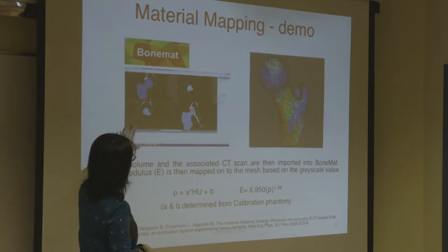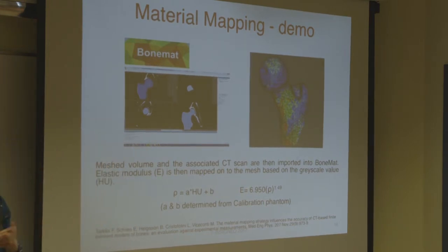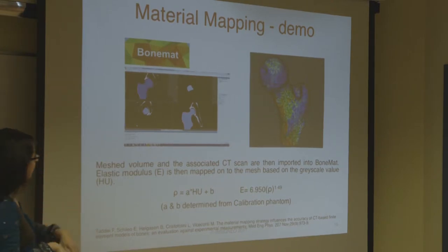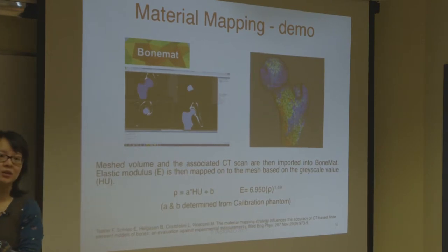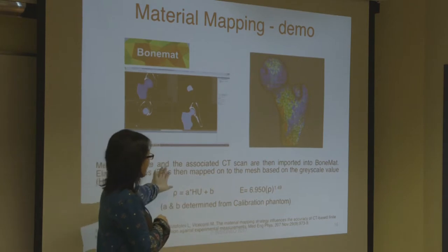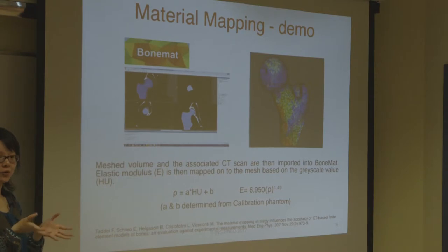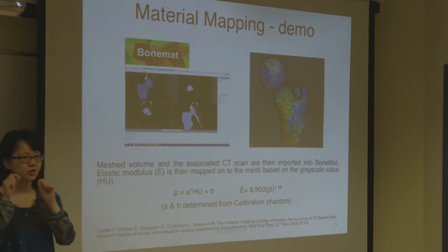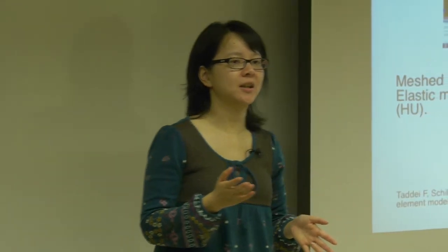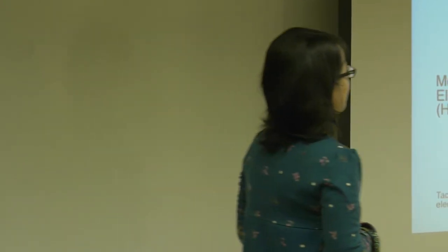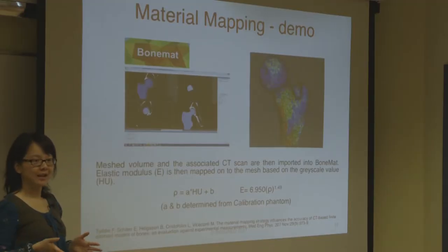Material mapping uses the Bone Mat software. Once you have your FE mesh, you load up your FE mesh and CT images together, making sure they overlap — you've got the CT in the background and the FE femur sitting nicely on top of the CT DICOM images. The software estimates the Young's modulus of your personalised model based on the attenuations in the CT scan. Zooming into the CT scan, you see different shades of grey inside the bone: more white means the bone is stiffer, more grey means softer. Soft tissues are all dark grey and black. This is the value used to estimate our Young's modulus.